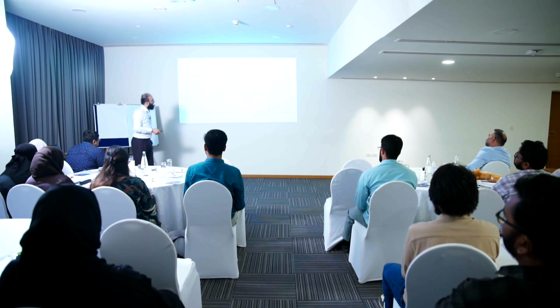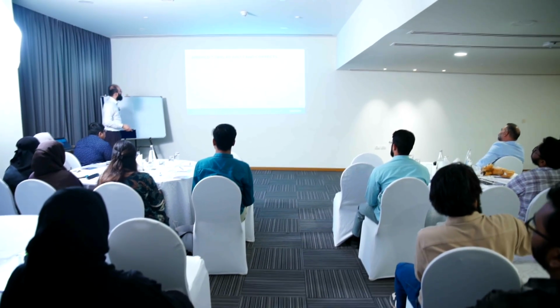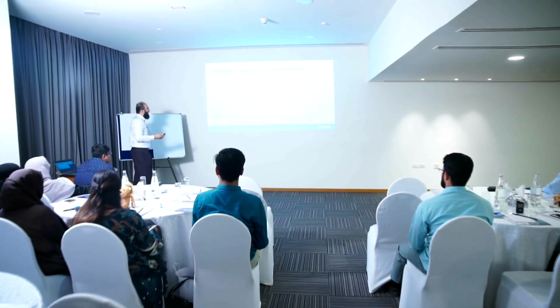Okay, let it continue. But if it is going lower than 70 or going beyond 180, that is when it acts. But the 780G starts acting at 150 only. Control to target system. So the 780G adjusts and corrects glucose level automatically 24/7. SmartGuard technology helps prevent highs and lows.